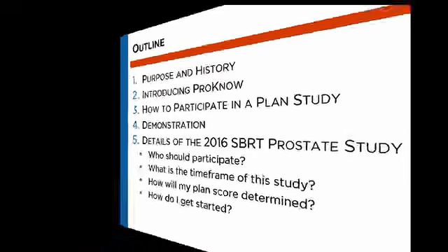and how do I get started? Now, many of you may be new to dosimetry or new to the plan study program, so I thought I'd spend a little time to remind everyone of the purpose of why we do these studies, and then to go over the history.